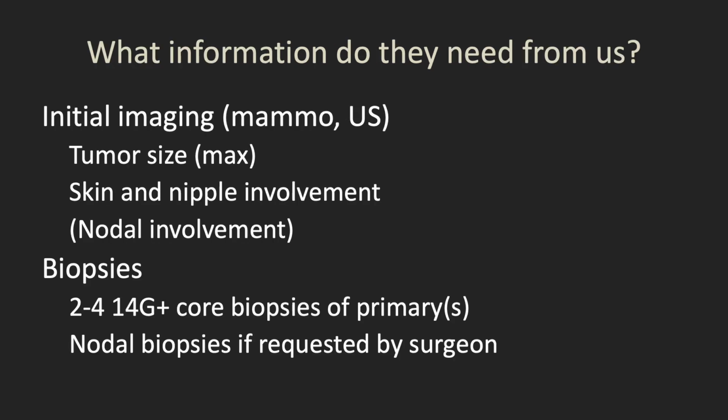Now we've had the outline of the TNM staging, what information do the oncologists, the surgeons, and the radiation therapists all need from us? Well, on the initial imaging, which is usually some combination of mammography and ultrasound, they need to know the maximal tumor size, as we talked about, whether the skin and nipple are involved, and possibly whether there is any nodal involvement, and we'll talk more about that in a sec.